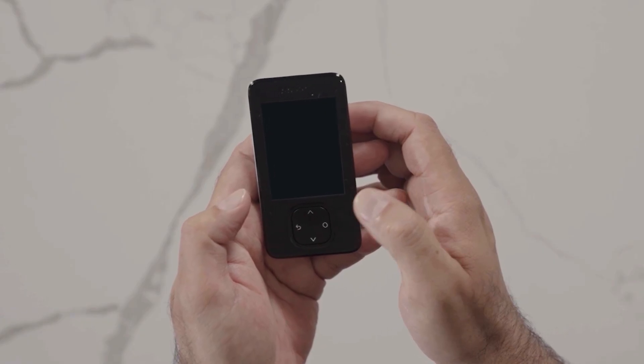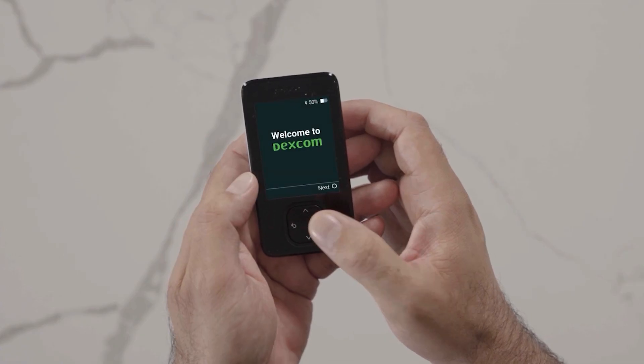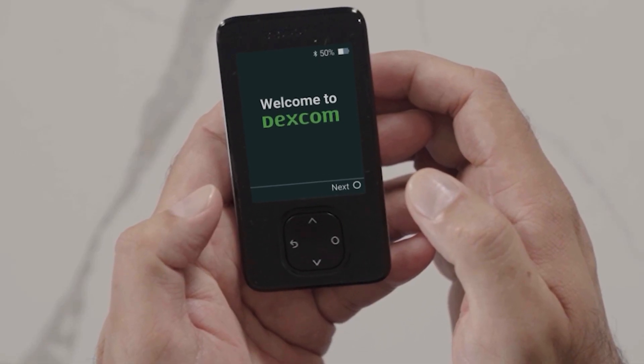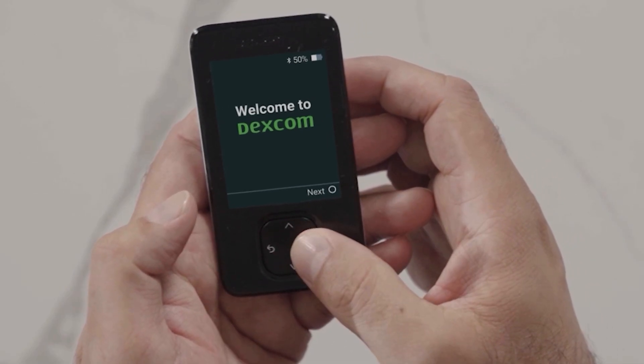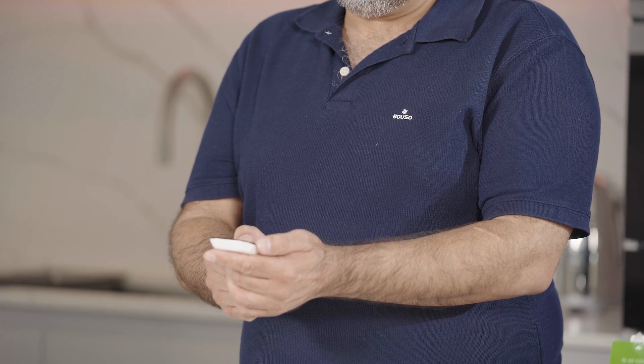To turn on your receiver, press and hold the select button for three seconds. The receiver walks you through the entire setup process step by step. Select next to continue. First, you will accept the Dexcom Terms of Use and Privacy Policy and set your date and time.